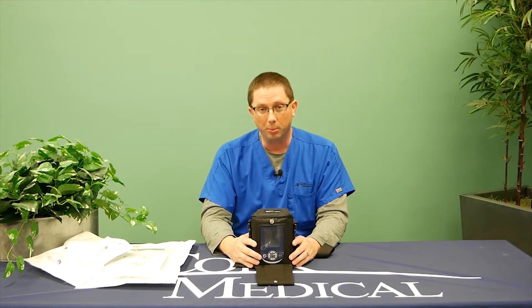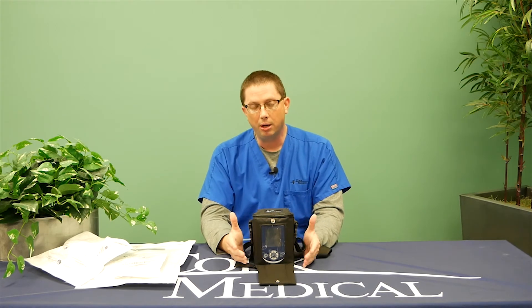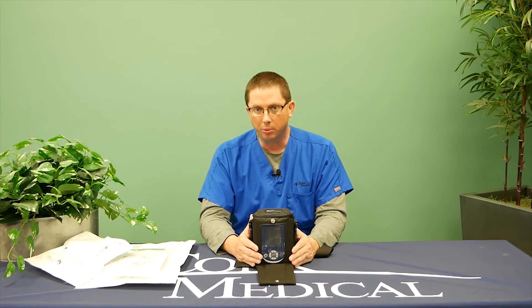Some common questions and answers with negative pressure wound therapy. How long will this device take to heal my wound? That all depends on your wound condition, the etiology of your wound, and the location of your wound. On average, most patients can wear this device from one to four months, depending on wound progression.